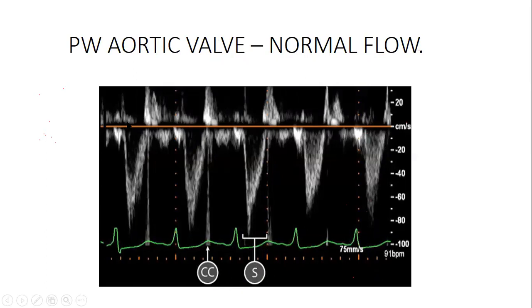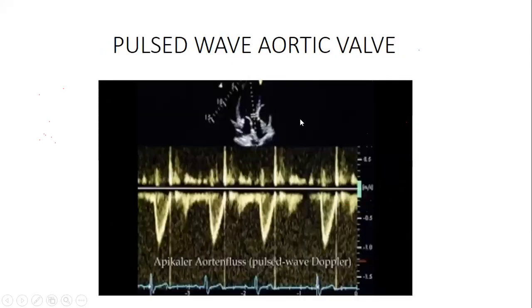So the moment I have another flow here, behind here, I'll show you how to quantify aortic regurgitation, because aortic regurgitation is a positive flow. It will go towards the left ventricle. So when the aortic valve is regurgitating, blood goes into the left ventricle, and going to the left ventricle simply shows positive regurgitation.